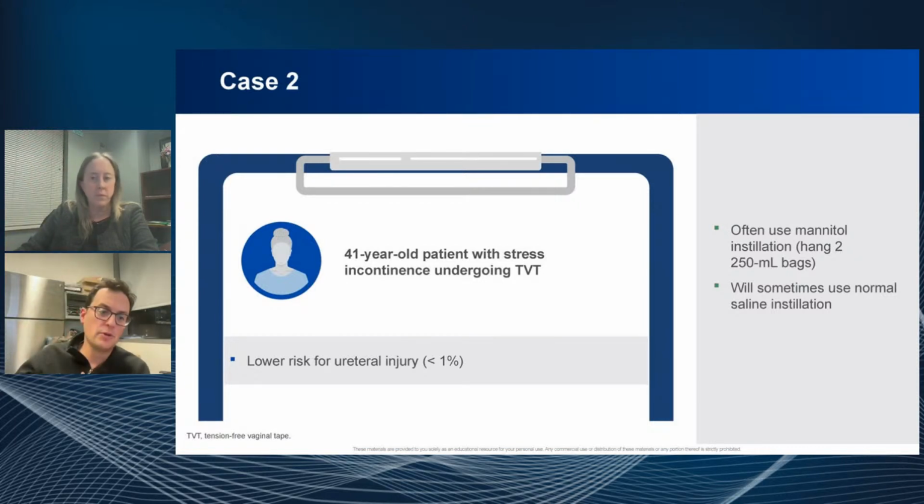Yeah, and I personally don't do a cystoscopy on a straightforward retropubic sling case, but at the same time, I would never fault anyone for doing it. I think it's good, and if it helps you sleep, great. But it's nice to see you use a different agent, maybe in a different way, just to at least answer your question. And if you're going to look, to your point, you might as well look.